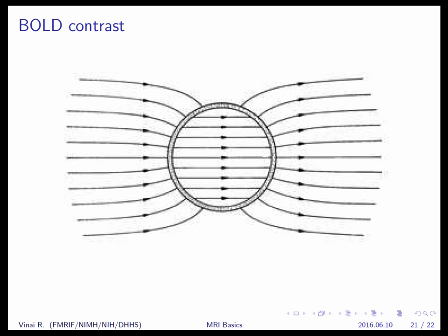Turns out that deoxygenated blood, i.e. where there's a little bit of hemoglobin where oxygen is not bound, is what we call paramagnetic. So it means it has a propensity to increase the local magnetic field around it. So that's why in the blood vessel here, these lines are closer together. When the magnetic field lines are closer together, it means that there's a higher field.